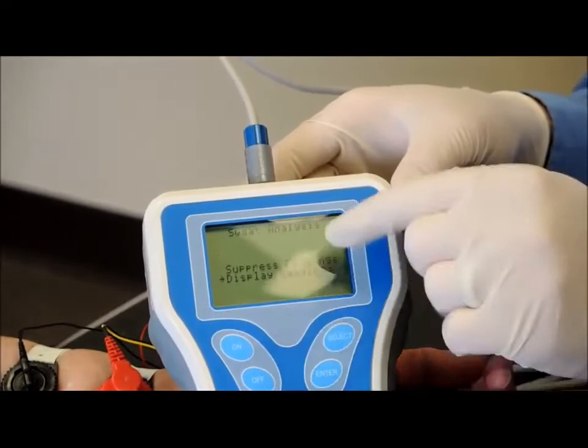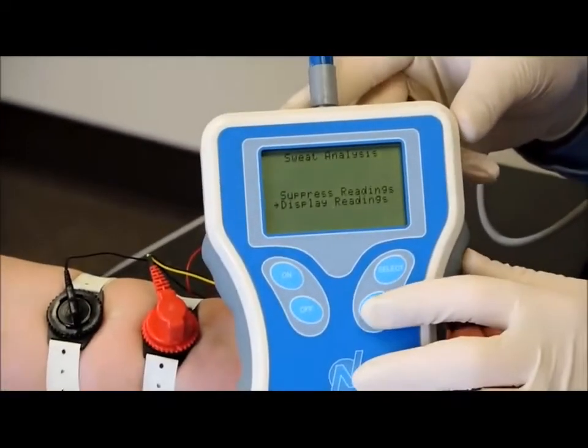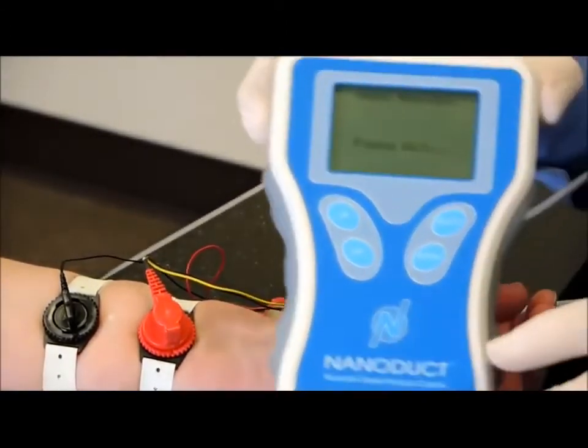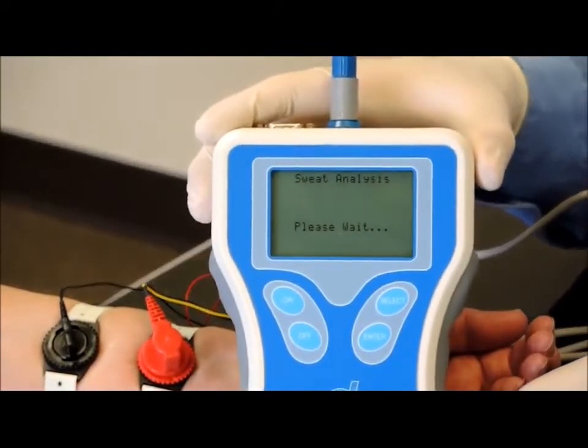But in this case, I'll choose display reading. The arrow is pointed towards display reading. I'll choose enter for that. So now the Nanoduct says, "Please wait," and we just need to wait.